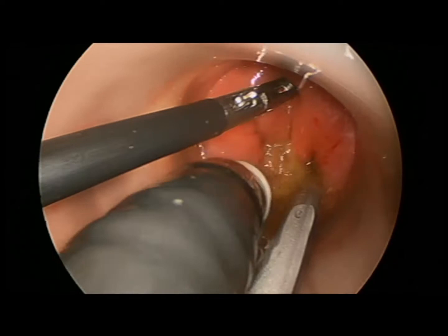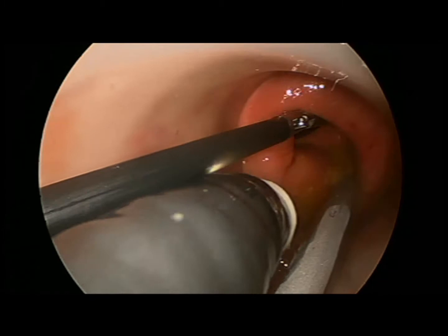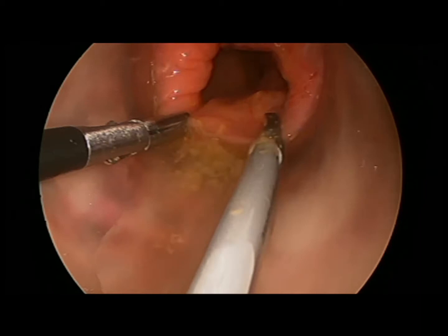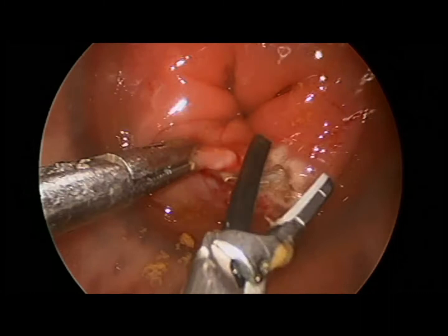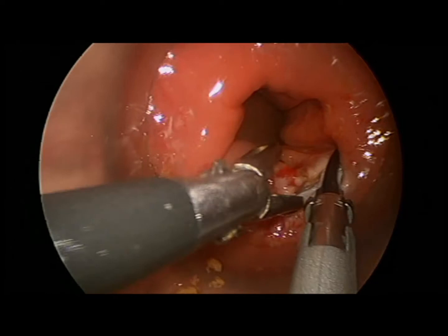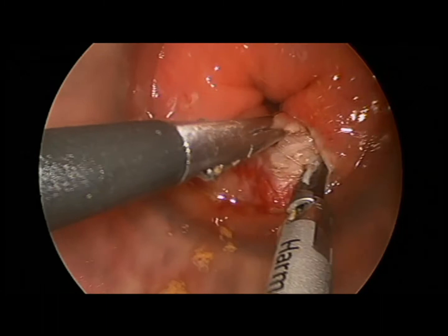As we are watching, a TAMIS resection was performed with intraoperative support of echoendoscopy. A GelPOINT Path device was placed, allowing the use of an echoendoscope through a 12 mm trocar. Another trocar for the 10 mm camera and trocars of 5 mm were placed as work channels.